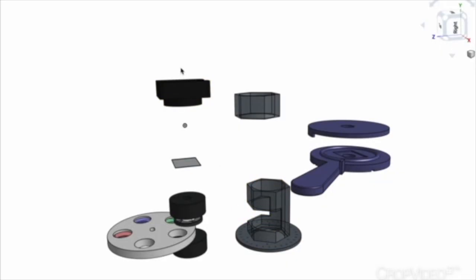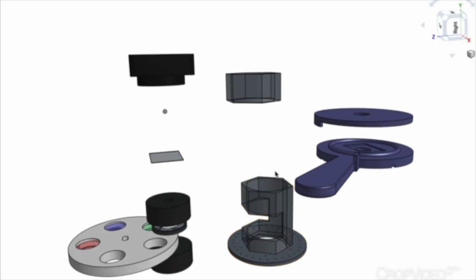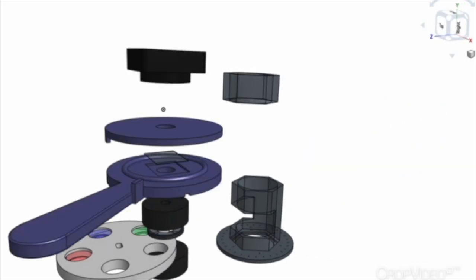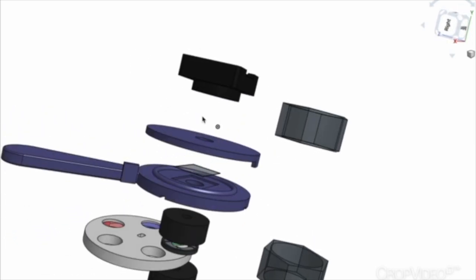Here in our CAD model, I'm highlighting the imaging path through the center optical stack to where the skin sample would be at the bottom. The purple case with a handle is to hold the polarizing film. As I move this part into the main stack, you can see how the two parts surrounding the polarizing film hold it together. The handle attached will make the polarization manually adjustable for the user's preference when imaging.